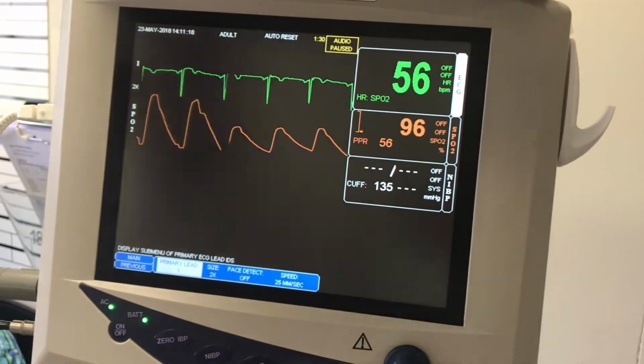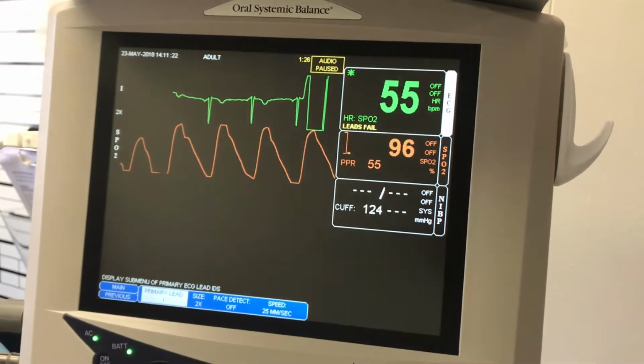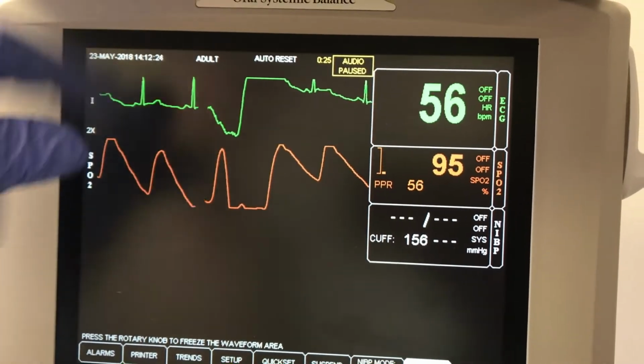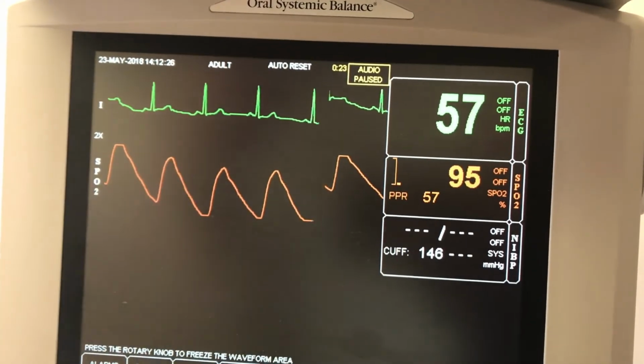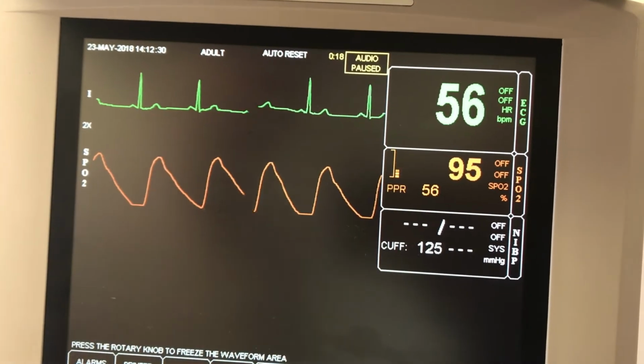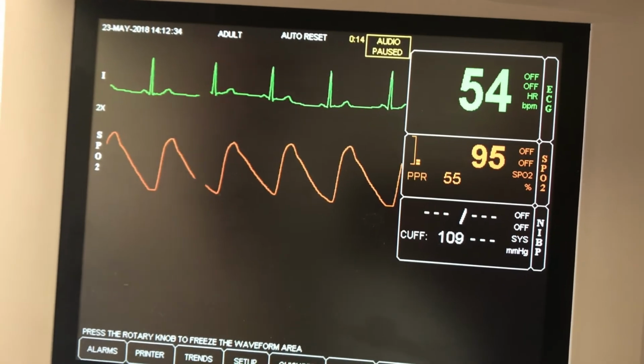I got them on the wrong one. See how that's upside down? It looks a lot more normal when you do it this way. The white goes on the right. All right, this is the way it's supposed to be. That's a QRS wave, and this is an SpO2 wave, and we're going to talk a lot about that.